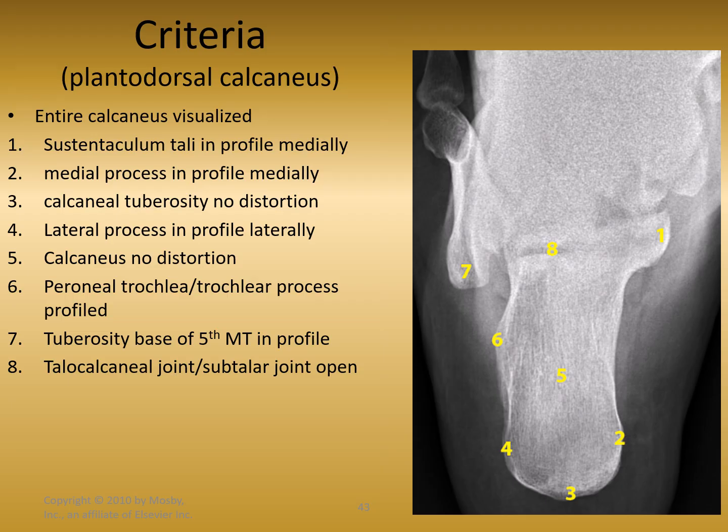This is a very nice view of the calcaneus, but it does have some quantum mottle. I'm pretty sure that as soon as you saw it, you could recognize that graininess in the image up here, but this is not the area of interest. Down here at the calcaneus, I can see the trabecular markings, those lines going through that spongy bone, showing very nicely. The calcaneus is shown without any elongation or foreshortening.